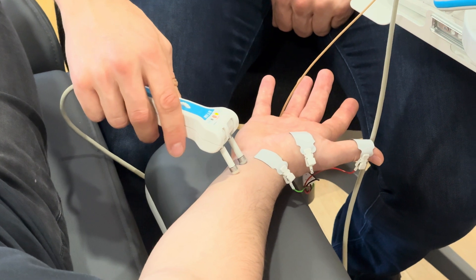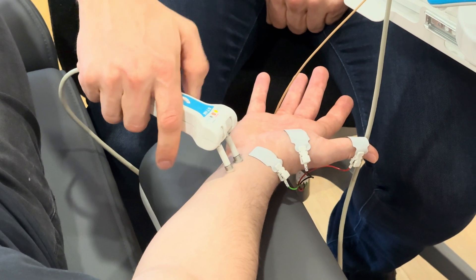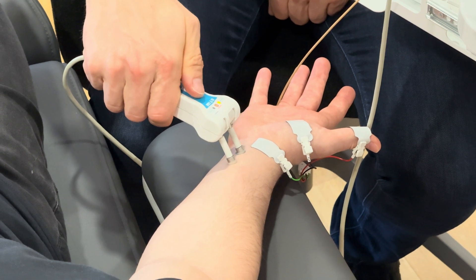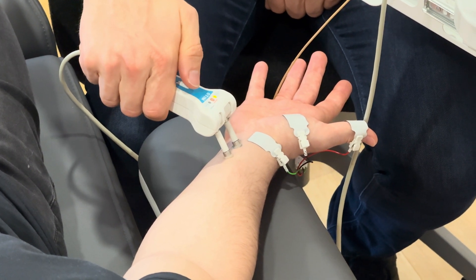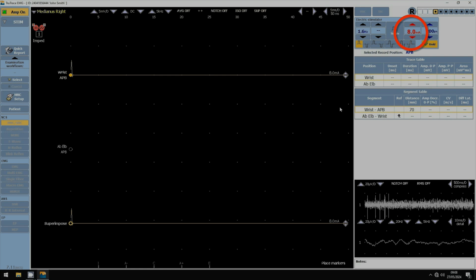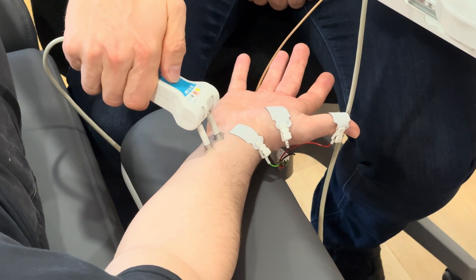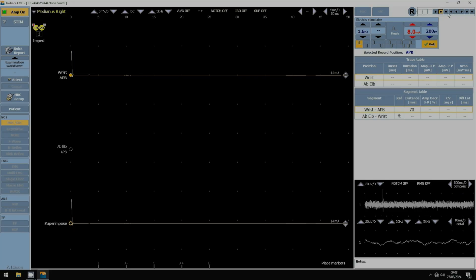I put the cathode on my marker and I stimulate using the wheel, increasing from 5, 6, 7, 8 mA. I give one stimulus. So far I don't see any response. I give a slightly higher stimulation and I start seeing a small motor response.